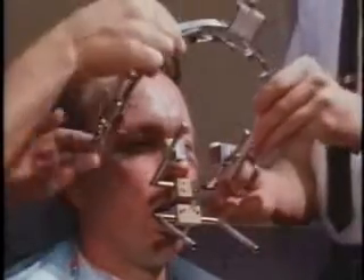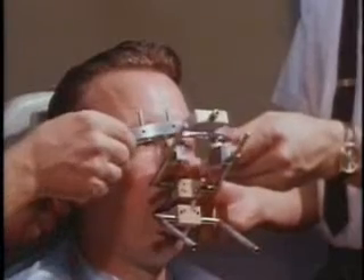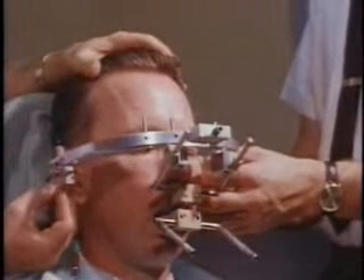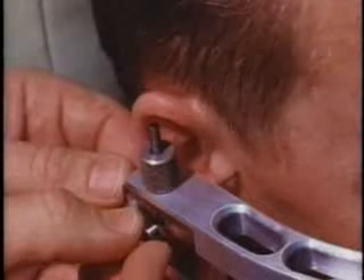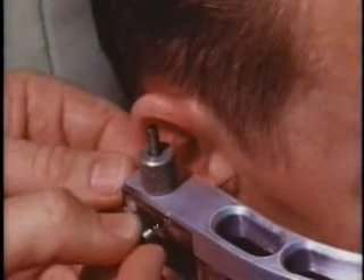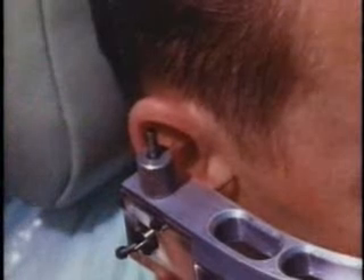This is accomplished by inserting the ends of two vertical rods of the bow into the soft plaster. While the plaster is setting, the points of the two alignment pins are held to the axis spots which have been previously located and marked by conventional methods. This procedure not only centers the bow on the patient's head, but also orients it so that the axis of the two alignment pins is co-linear with the hinge axis of the mandible in centric relation.